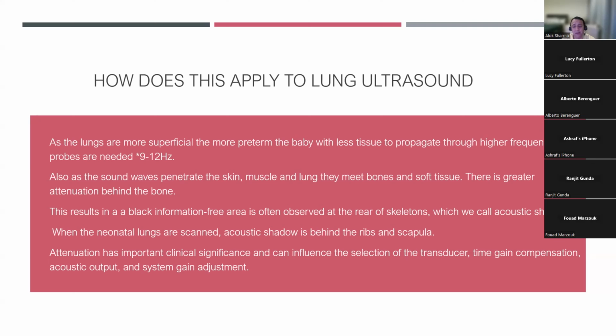And it's going to create a lot of confusion in my mind, especially when I'm starting out, because I may not understand that. But I also want to explain a simple example. I want you to look at me in the screen. If you're using a linear probe, and this is your probe, this is the linear probe that's going to give you sound waves. Now, a simple example is that if this has to be applied to tissue and you don't have it applied in entirety, so if this is the probe face, and this probe is lifted, there is suddenly going to be problems with air between the interface. If it's completely lifted or you don't have good apposition, there's going to be air within the interface.